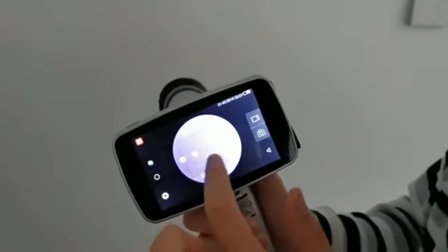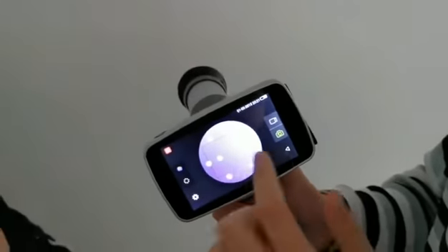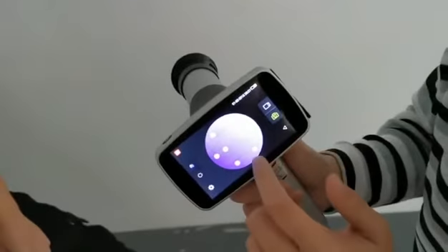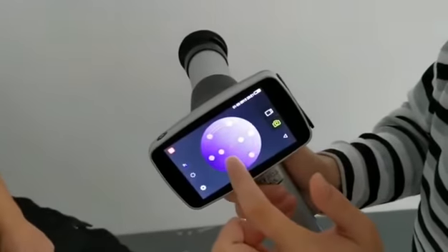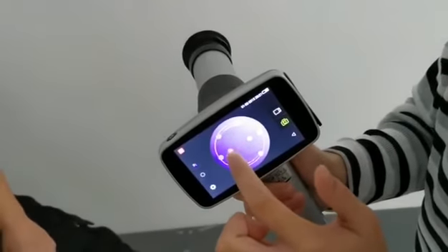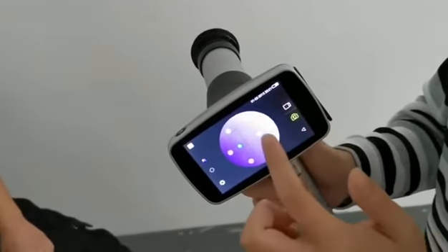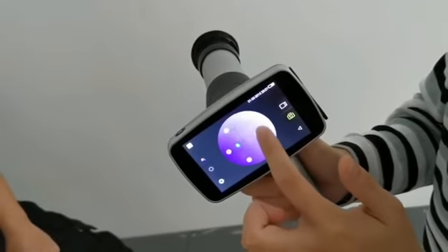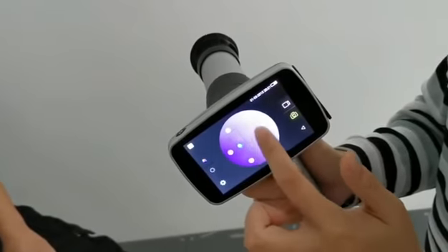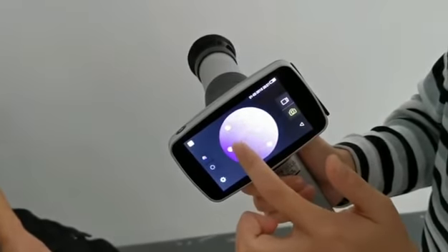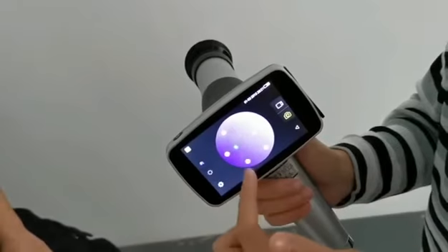In the middle, if you take an image of the left eye, you choose the left point. If you take an image of the right eye, select the right point. Currently we will take the left eye, so I selected the left point in the middle.